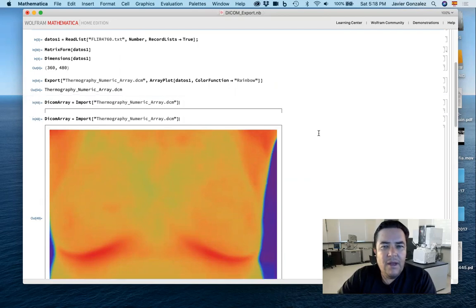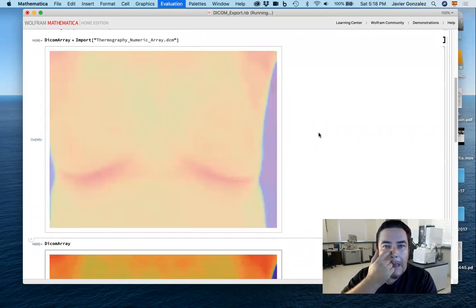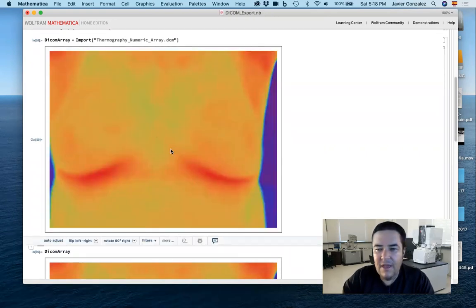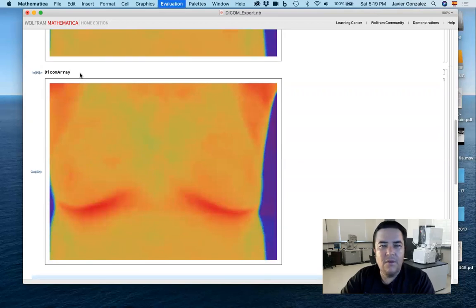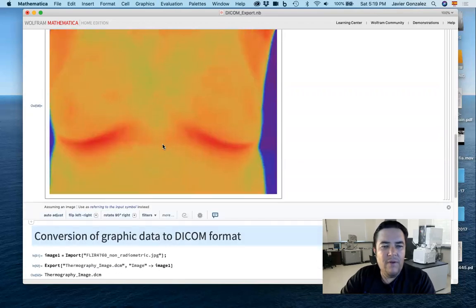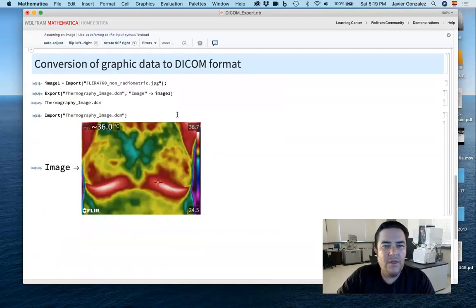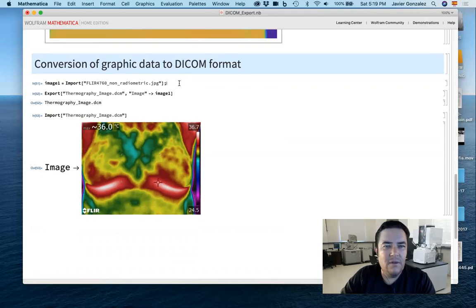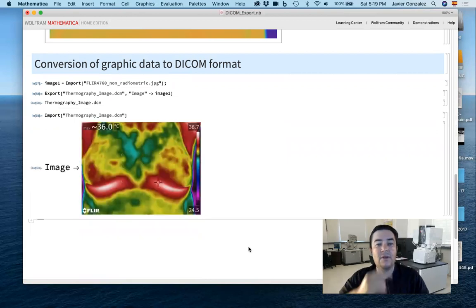So now I can import my DICOM file and I can see it here. So this has all the radiometric information, right? Here is my DICOM array, and I can use it however I want. I can also convert just the image without the radiometric information. This is the non-radiometric image. I can export to DICOM, and then I can see it here.